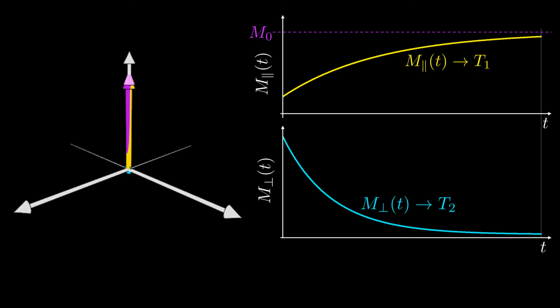Its transverse magnetization will decay to 0 at the T2 rate, and its longitudinal magnetization will return to Boltzmann at the T1 rate. Because of the precession phenomenon, the amount of our magnetization in the transverse plane dictates the amount of signal we detect, which we saw last time increases as the precession frequency omega increases. And thus, we report an expression describing NMR signal of a sample. The signal is proportional to the number of spins in our sample times the magnetic moment of an individual spin, times the fraction of those spins contributing to the NMR signal, times omega, which is gamma B0.